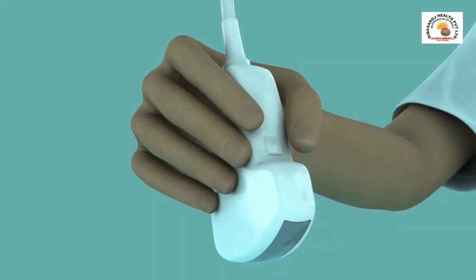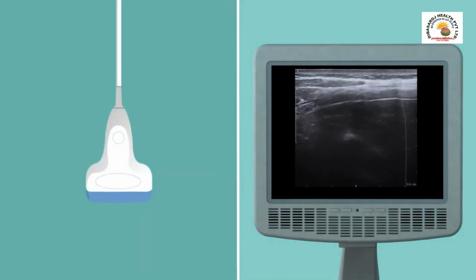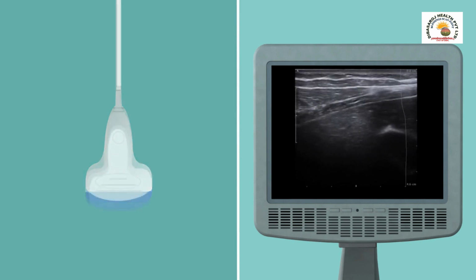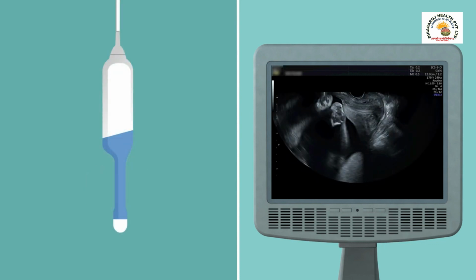The shape of the image displayed by the ultrasound machine depends on the arrangement of the piezoelectric crystals within the probe. For example, a probe with a flat face or footprint has a rectangular or linear image. The curved shape of the curvilinear transabdominal probe, commonly used in obstetrics, produces a fan-shaped or sector image. The footprint from the transvaginal probe is also fan-shaped, but typically has a wider sector angle than the transabdominal curvilinear probe.